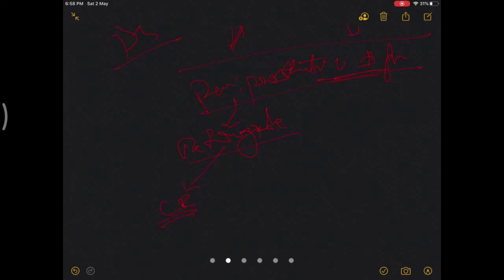So you can easily have intramedullary access through the notch in the CR. Whereas in PS, you will have to burr out the box with a diamond tip burr to get access into the intramedullary cavity if you are planning for a retrograde nail. So this is one theoretical advantage which CR has.